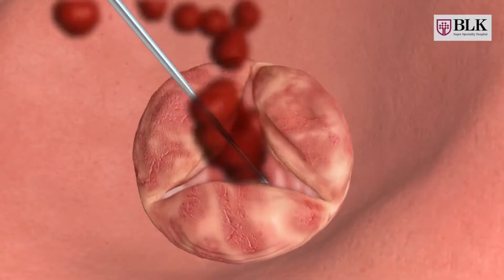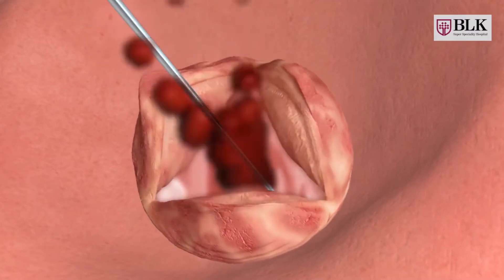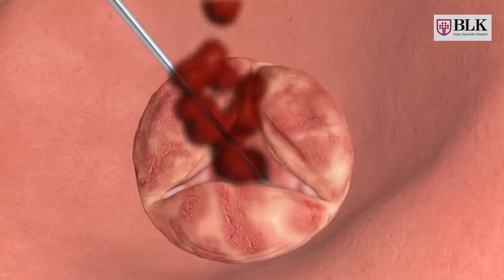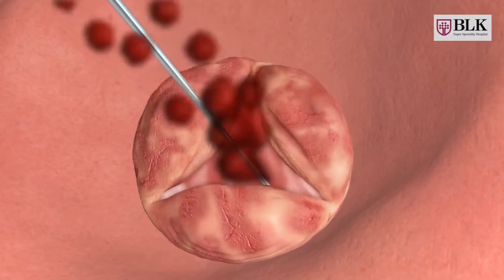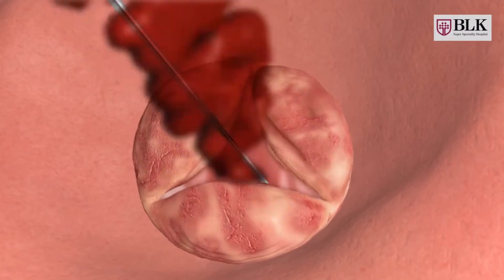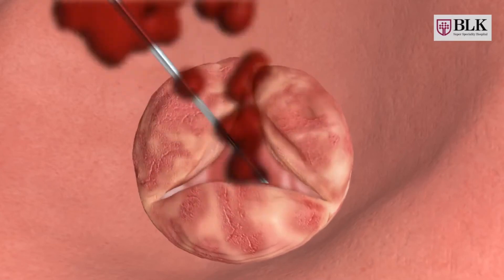Now you can see this is the aortic valve, which normally should open completely. The movements of this valve are restricted — it is a diseased valve and is not pumping the blood the way it should be because the orifice is very tight.